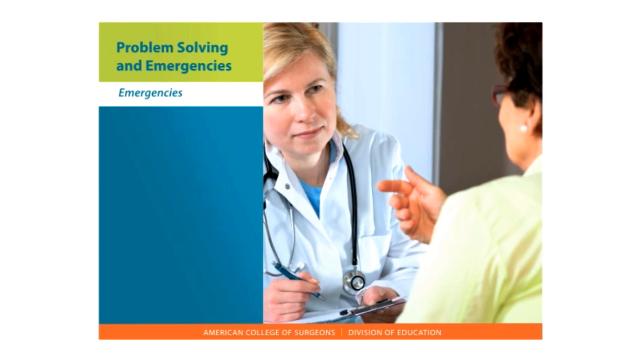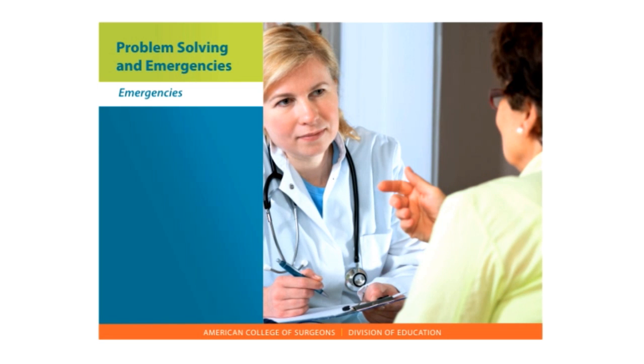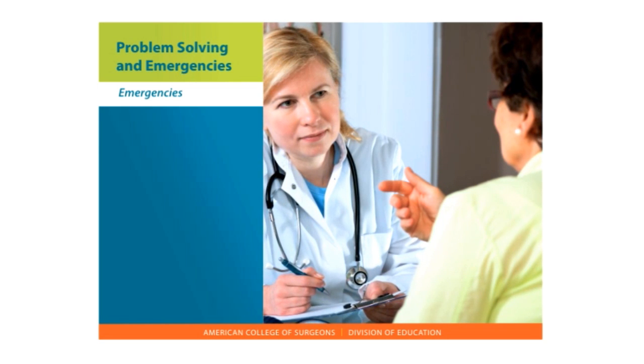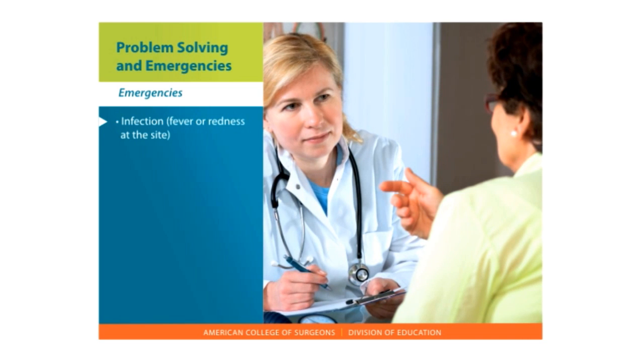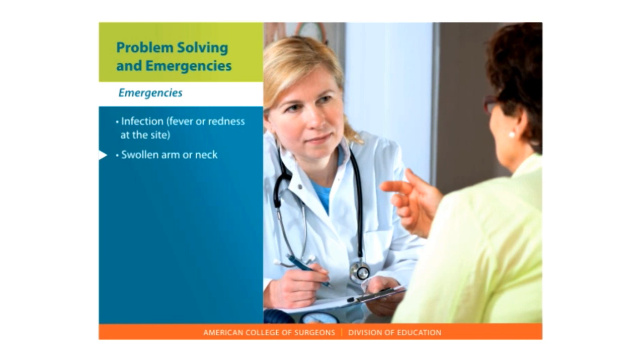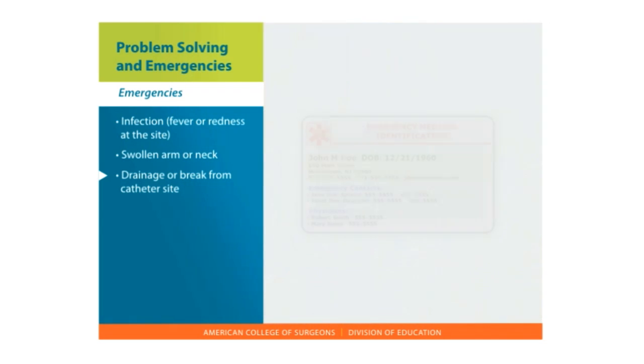Emergencies. If you experience any of the following things, contact your surgeon or nurse immediately, or go to the nearest emergency room. Infection, fever or redness at the site. Swollen arm or neck. Drainage or break from catheter site.